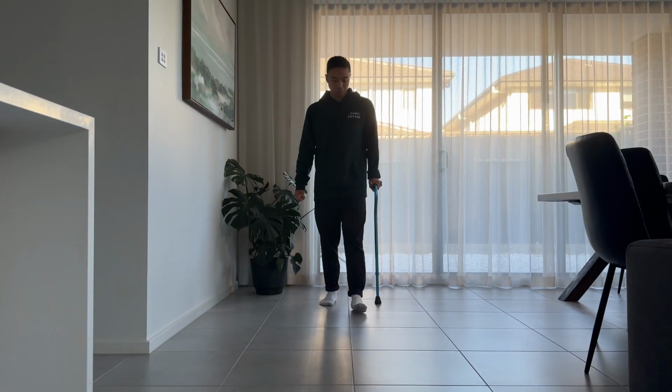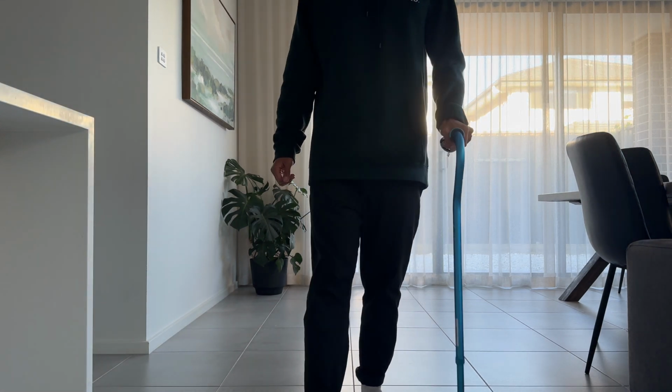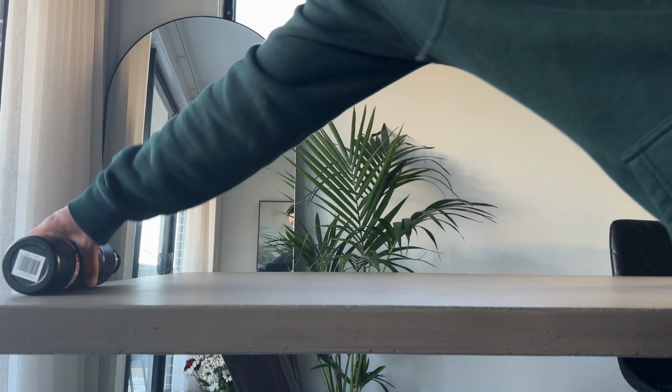When we walk with the walking stick on the opposite hand, it can actually support that injured leg really well. And it's like rolling a round barrel down a hill. We can make use of momentum to help us walk. It's a lot easier, a bit more effortless, and probably a lot safer as well.